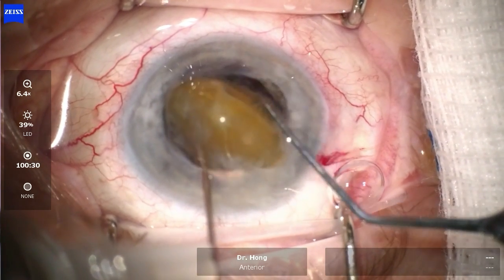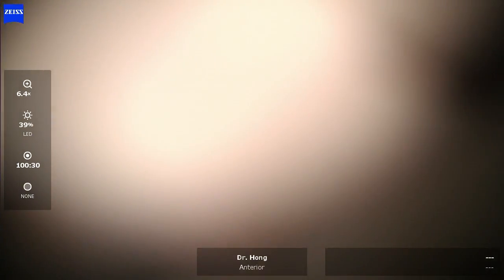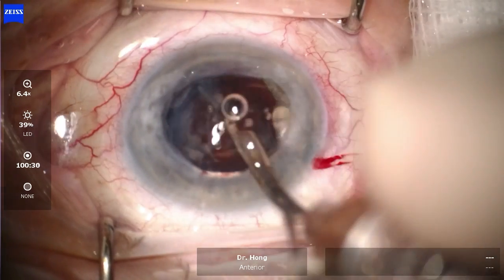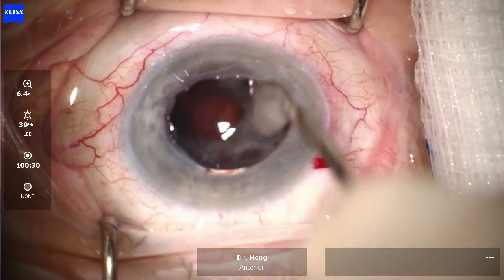Using a cystotome and a chopper, the cataract was then removed. The rest of the cortical material was then cleaned and removed efficiently and safely with a Simcoe cannula.